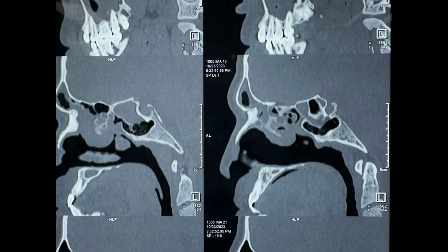This is the CT scan in the parasagittal section showing, on the right side, the presence of opacity in the already dissected ethmoidal cavity. This is a patient with nasal polyps post primary sinus surgery. What we can note is a large Onodi cell which is compressing the sphenoid sinus. The Onodi is opacified, whereas the sphenoid sinus looks to be quite clear.